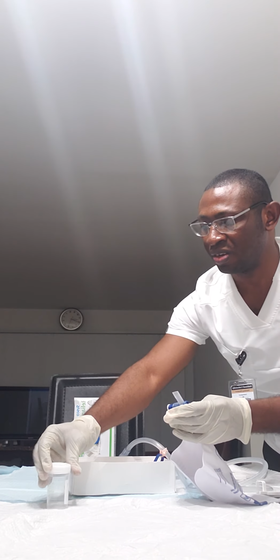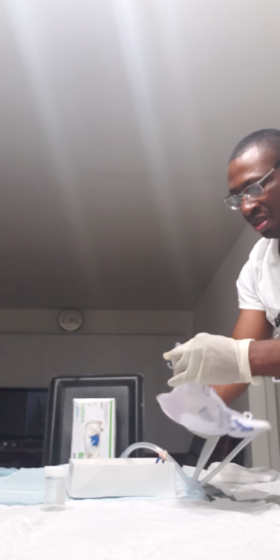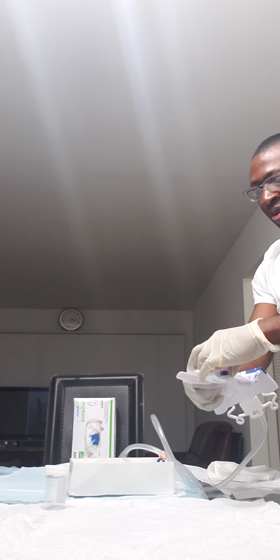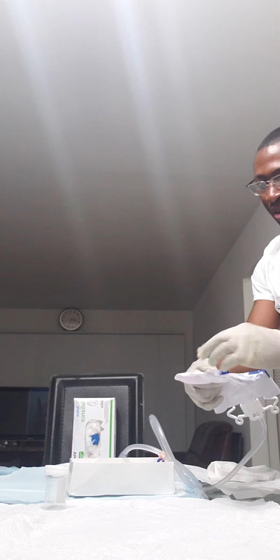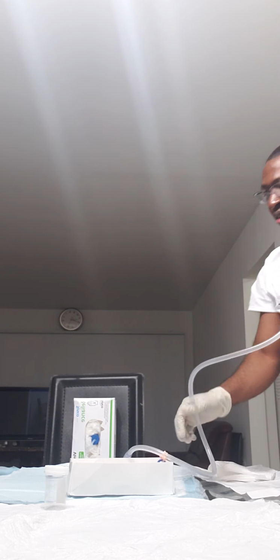I'm going to take it to the lab. Clean it with a swab, cover it back, pinch it back, cover it back. Then I take this one down and clip it to the bed.